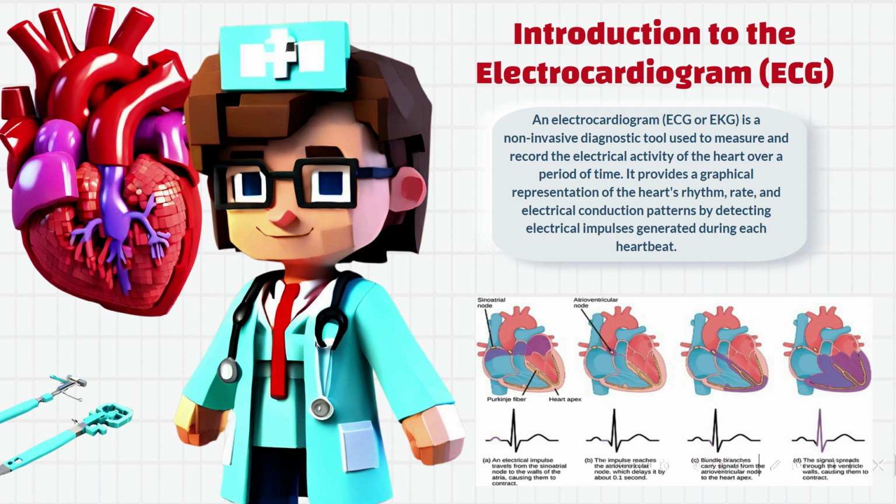ECGs are vital in clinical settings because they offer immediate insights into acute and chronic cardiac conditions, guiding emergency interventions, monitoring therapeutic effects, and they help predict patient outcomes in conditions like coronary artery disease, electrolyte imbalances, and heart failure.